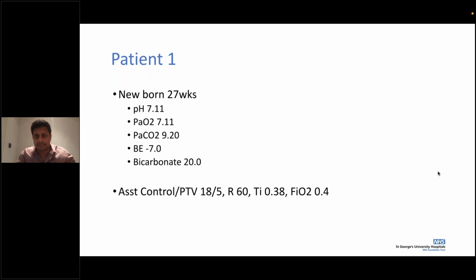So we've got one person saying consider Curosurf, and another saying has the baby had surfactant in this situation? The baby has not had surfactant, so I can see the chat, thank you. Now we've heard a lot about conventional ventilation, and there was no surfactant given. Yes, we must think about surfactant. Anything else?